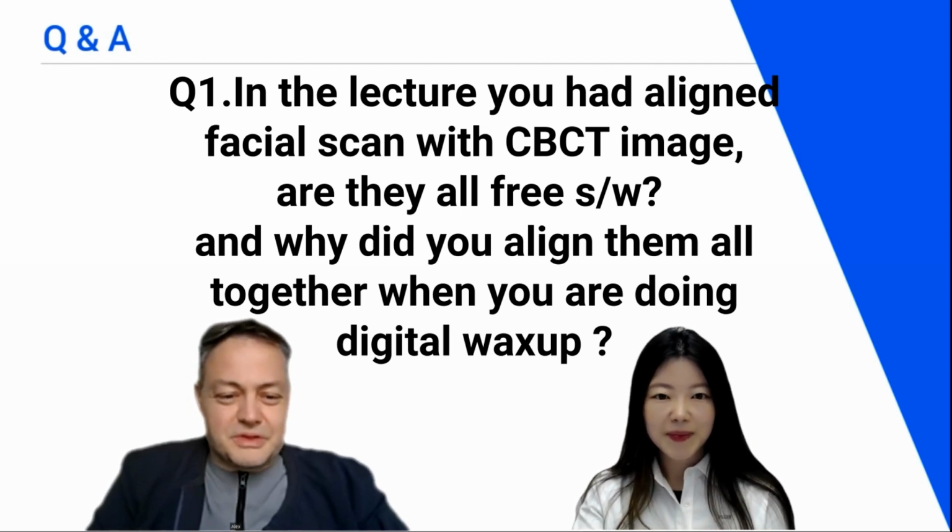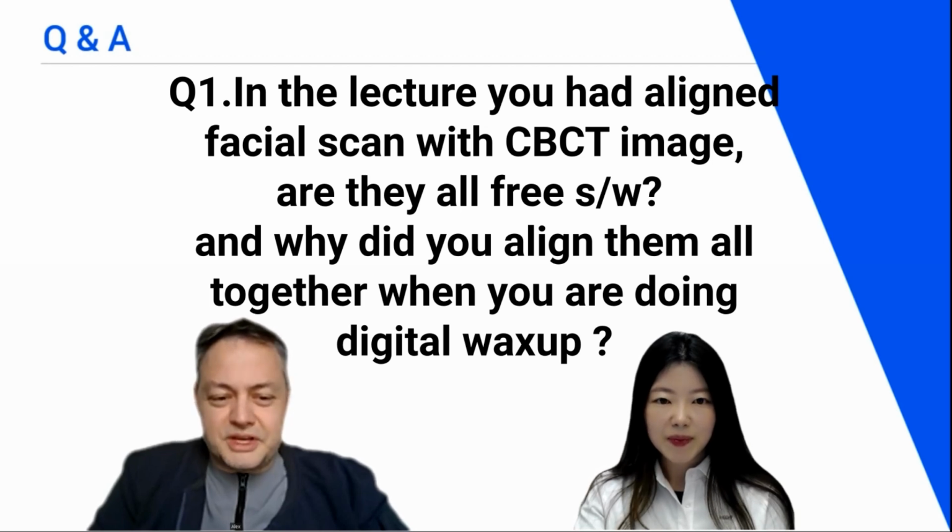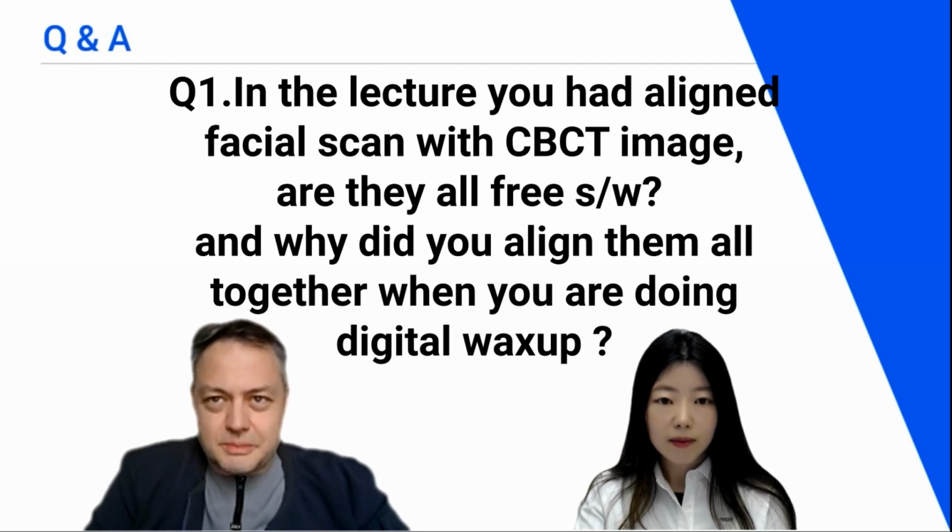So first, let's talk about face scans. Face scans can range from free software on your phone that gives a model of the face. Sometimes it's a low poly count, sometimes it's a better count regarding the program that you are using.